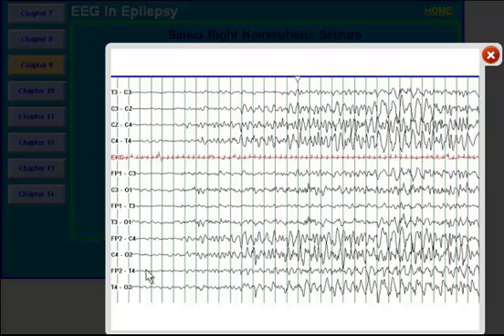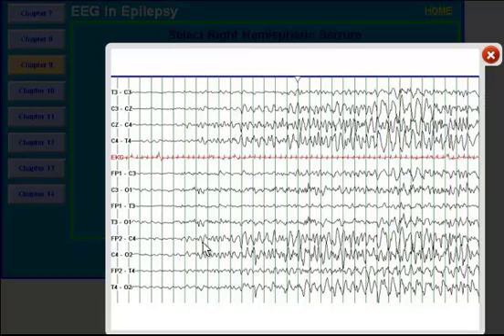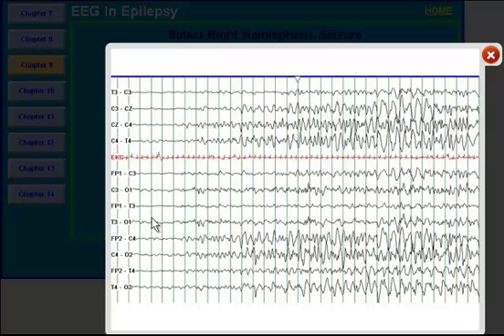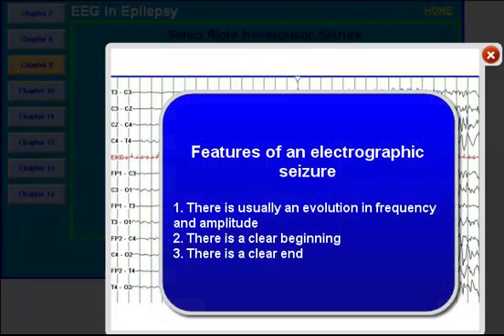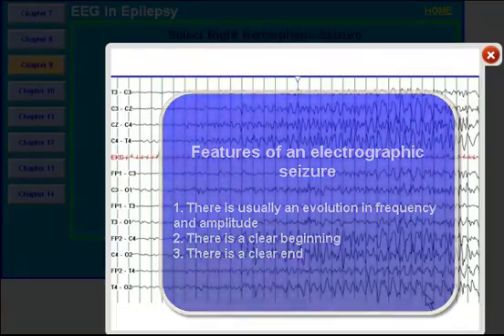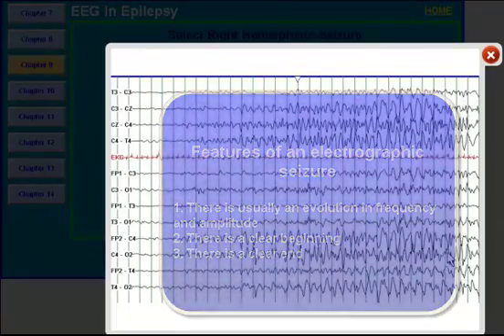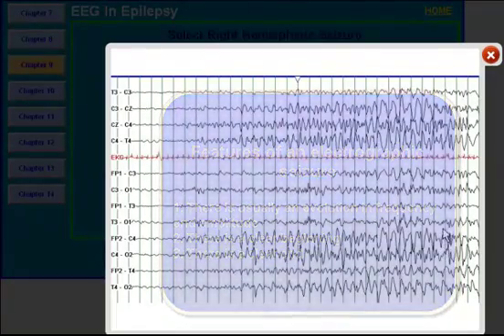There are a number of characteristics which define an electrographic seizure. Number 1, you need to see an evolution in frequency. You need to see an evolution in amplitude. You want to see a clear beginning which you see right here. And you want to see a clear end which you don't see in the EEG because it is only a 30 second segment.